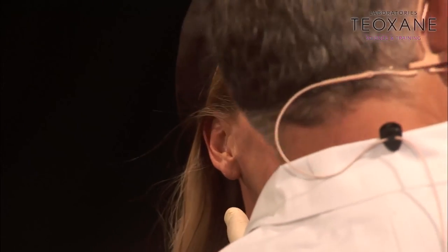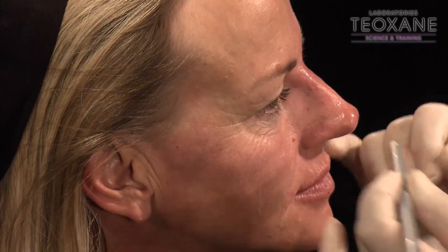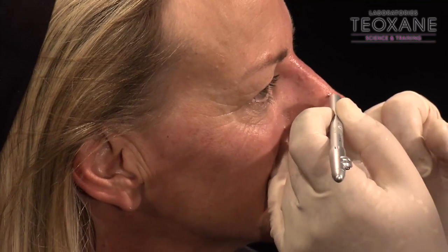And the tip of the nose, you see? In fact, it's a bit bulky, but not so much. I need to adjust a little drop on the nose. Give me the pencil. That's what you have to do to finish your work. You see, it's fine. If I put a drop here, it will be much better. Lips are fine. Smile, quite lovely. Nice definition. Need to put a tiny droplet here also.